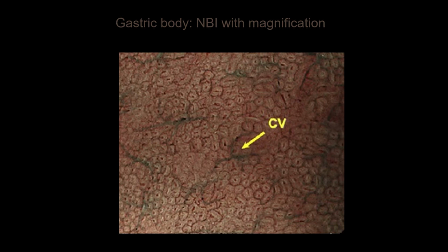Now when you see this, you have the boundaries, this hexagonal shape. Those are the capillary network. In the middle is the pit. So these pits are oval to round, but the boundaries are like a hexagon, like a beehive, and you see these greenish collecting venules. So just keep this in mind.